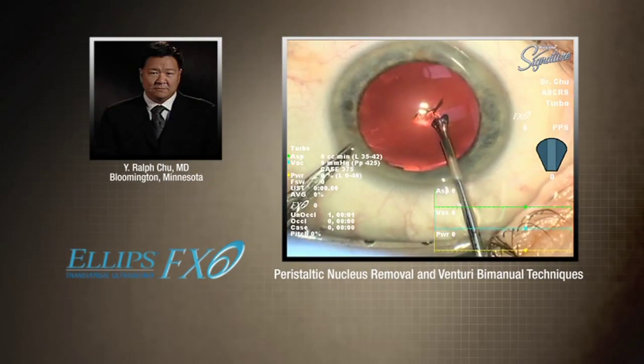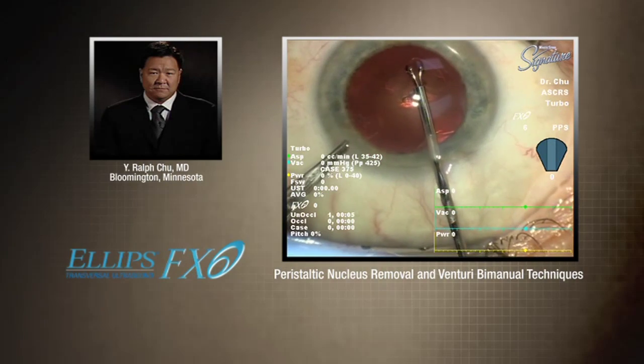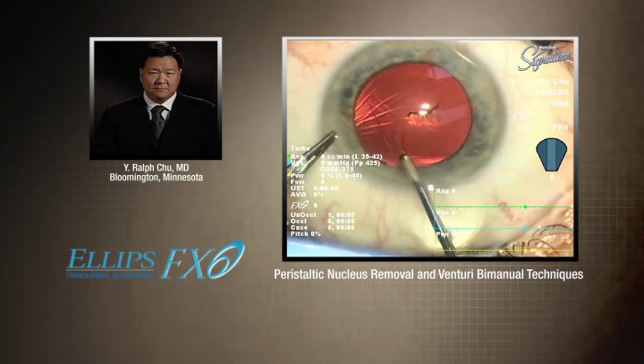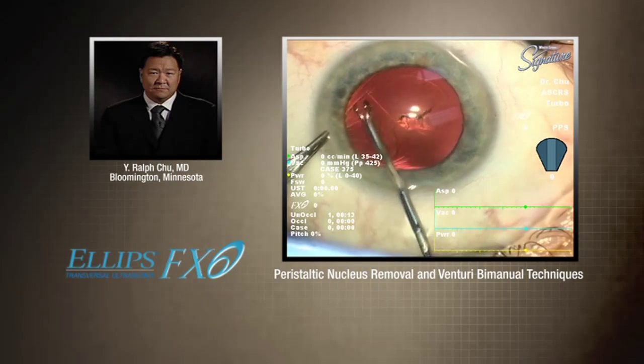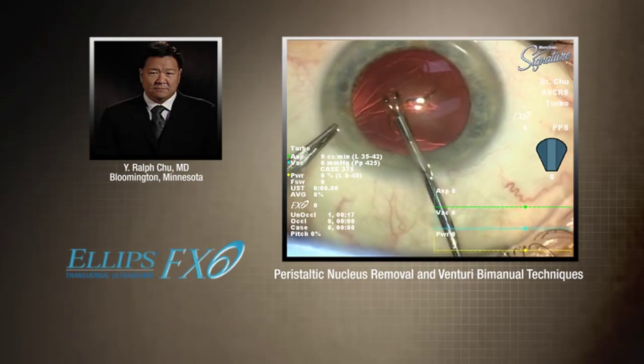What I standardly do is a little larger incision, a 2.75 millimeter incision. I just want to be able to use one incision size for all the potential lens implants we use, whether it's a Tecnis multifocal, a Tecnis one piece, or even a Crystalens accommodating lens.